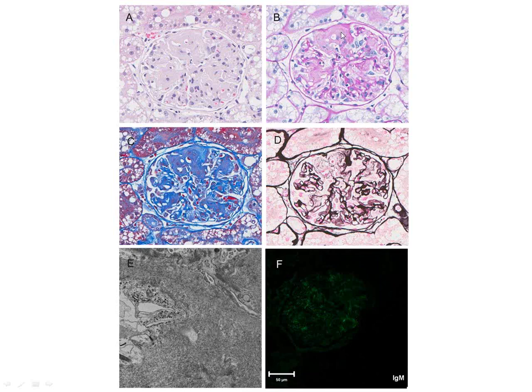So this here is just expanded mesangium, like Shannon said, and when you were looking here there was a little bit of pallor, and sometimes there was even a little bit of peach coloration. Amyloid often does that. It has kind of this mix. Here you can see a little tincture of peach material, and amyloid does that on a trichrome sometimes, not always, but sometimes. If it were really dark blue, then we would think that's probably more likely to be collagen. But the fact that it's got this haziness tells us it's probably not exactly collagen, or not just collagen, I should say.